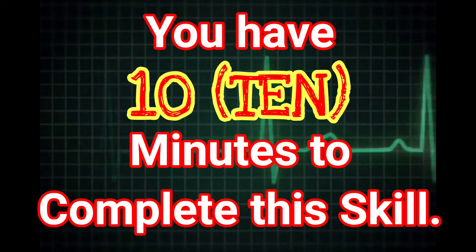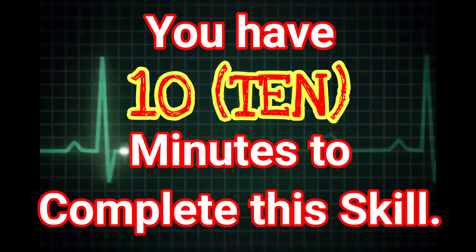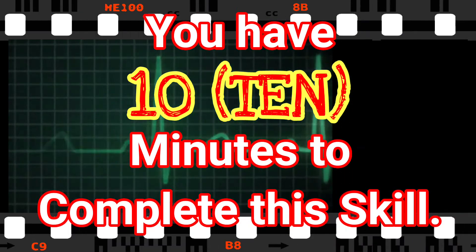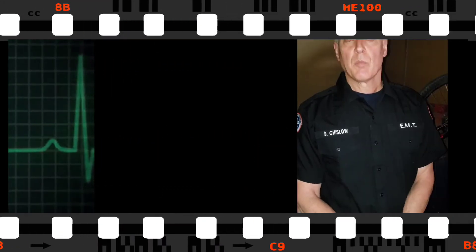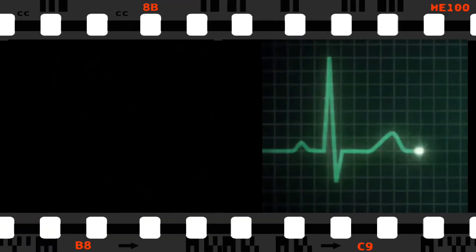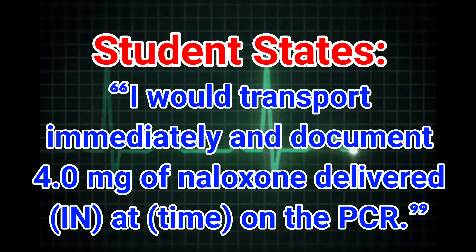You have 10 minutes to complete this skill. Make sure you document your findings in the PCR and transport the patient immediately.